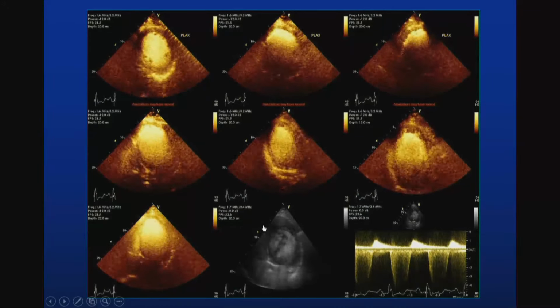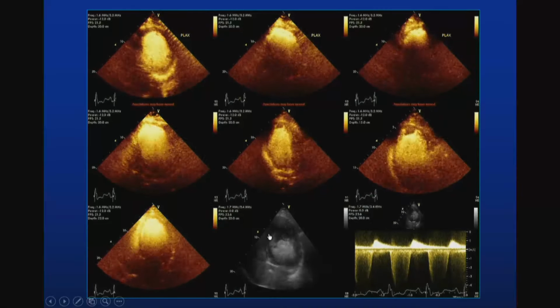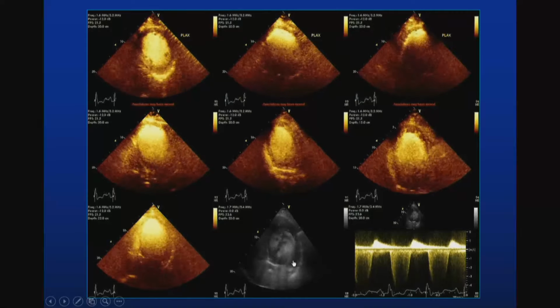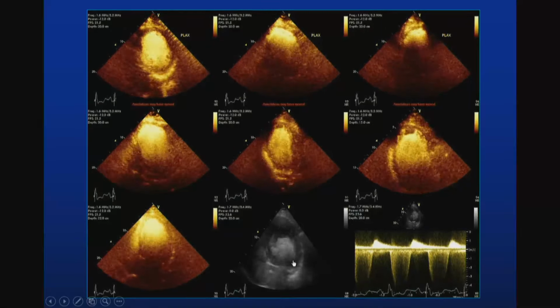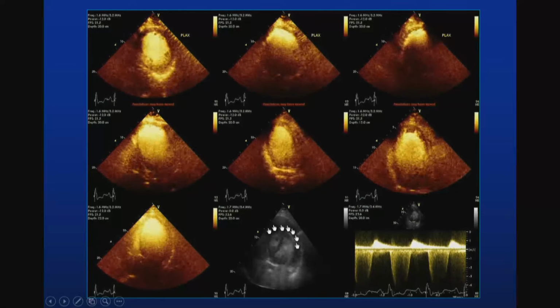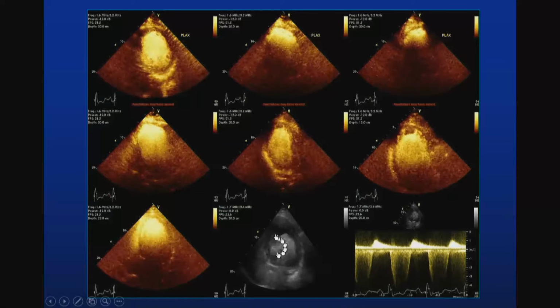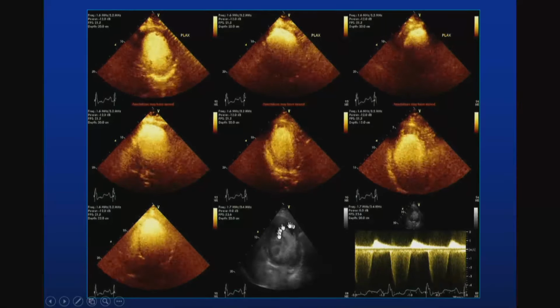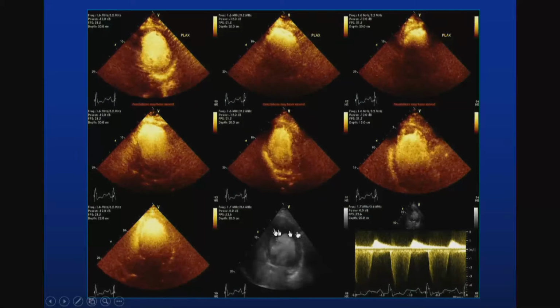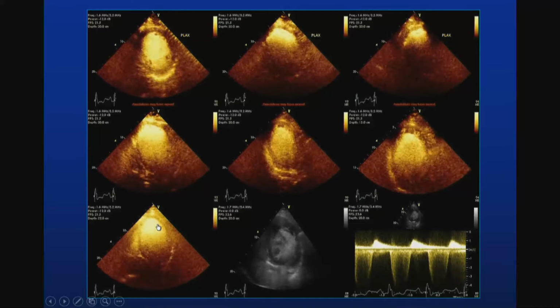What did they do? Because it looks very different now. And this is sequential. What they did is they increased the mechanical index to try to destroy more of the contrast. And what you ended up with, a lot of destruction, right? So we have a lot of destruction, almost like a hurricane heart when you see that, meaning some of the contrasts that are coming in being destroyed. So a high mechanical index, low mechanical index with a high bolus injection.